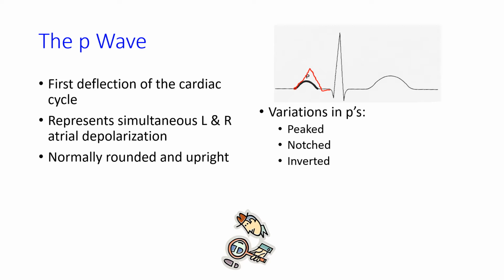And those patients who are COPDers often have very high right ventricular pressures because your pulmonary arteries are hypertensive or constricted, so it makes a lot of resistance for your right ventricle to pump against. When your right ventricle enlarges and has higher pressures, your right atrium has to try to pump against or empty into that higher pressure, and that can make changes in your right atrium, making it enlarged. Therefore you will develop what we call a P pulmonale, or a very peaked P wave.